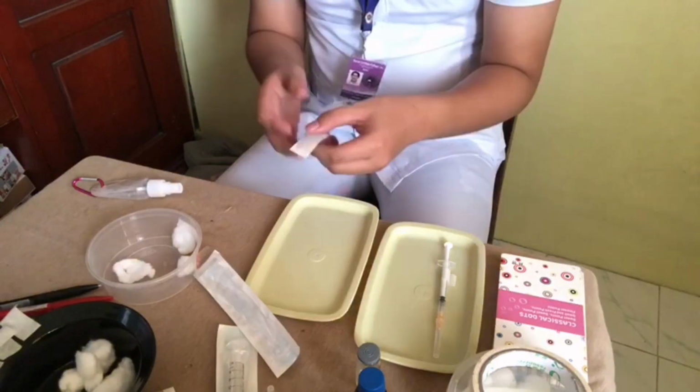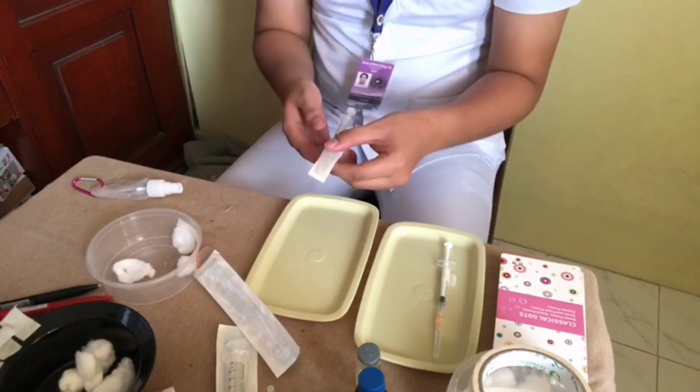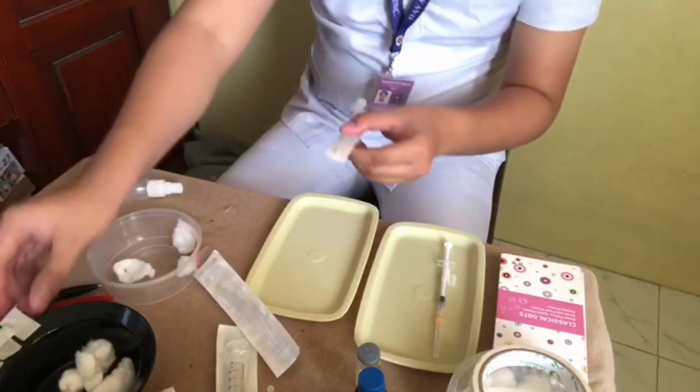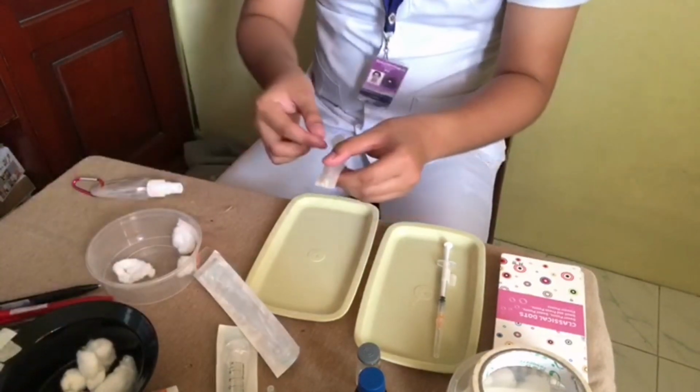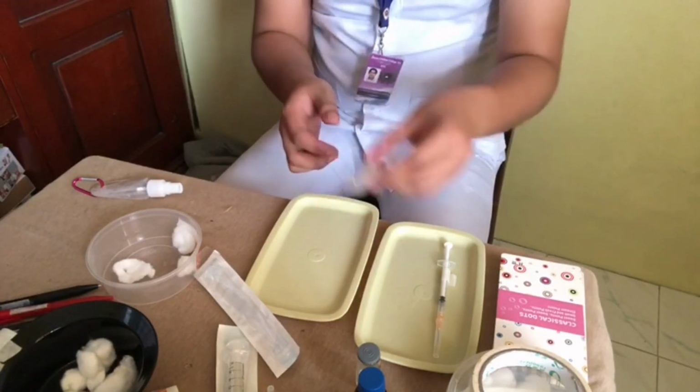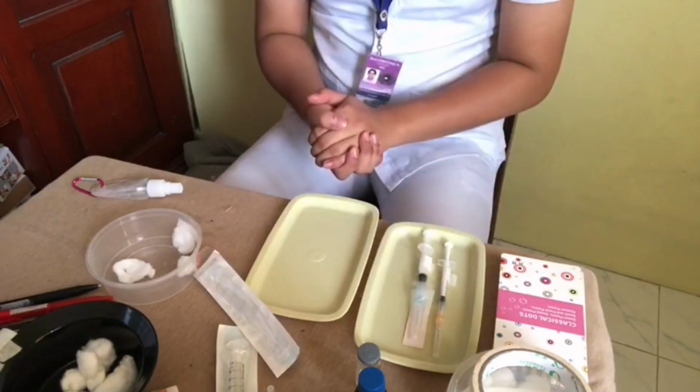So done. And after that, I am going to add a marker to know what the medication is.